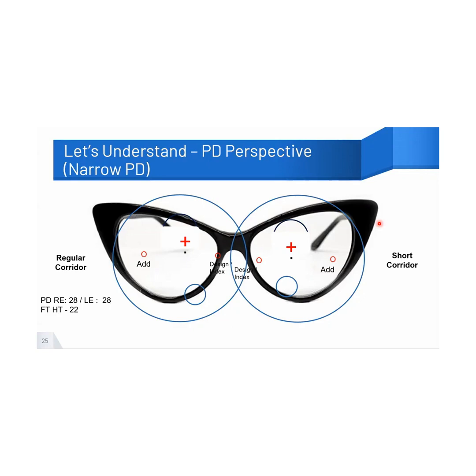Now, if the very same model comes in a smaller size, like your cat eye frame, which mostly comes in a size of 53, 54, but if the A size, the horizontal size, is under 50, then you can very well dispense this.